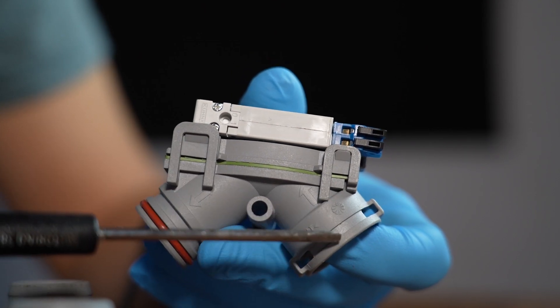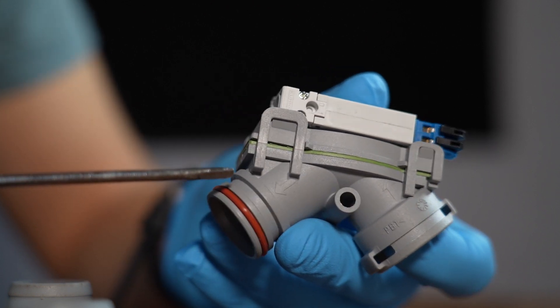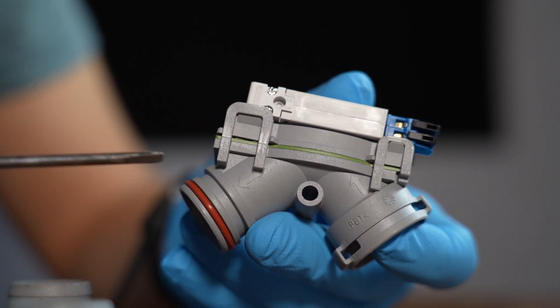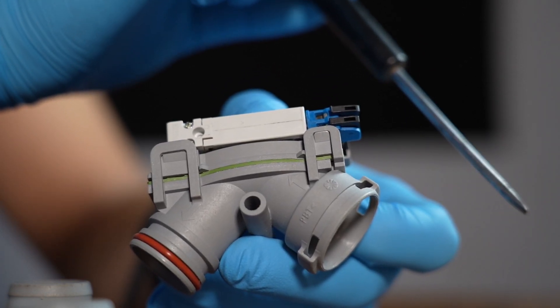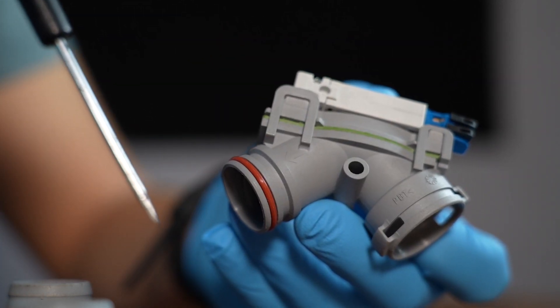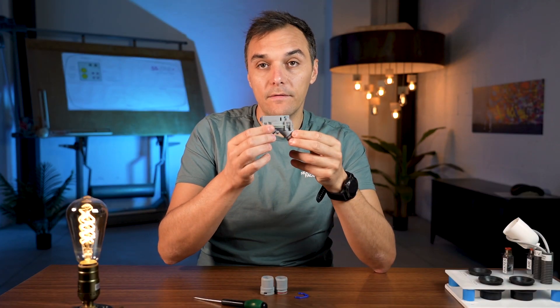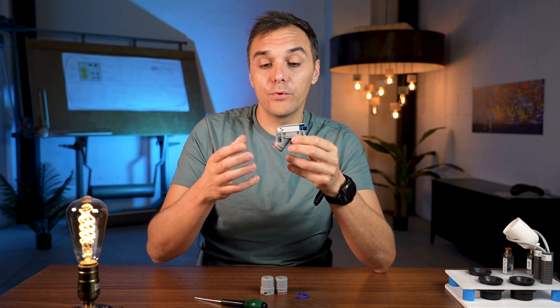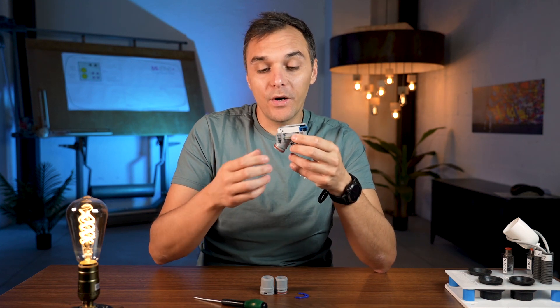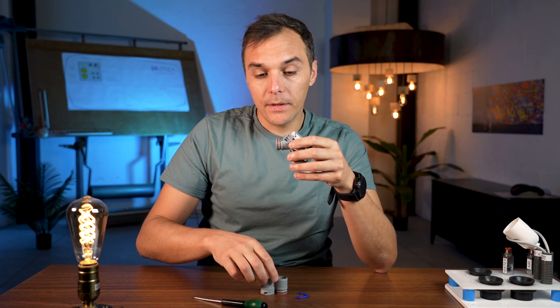We need to take care about the direction of the fluid, because there are arrows on the valve. Considering that you have the dental chair on one side and the suction motor on the other side, we need to follow the direction of the fluid. We cannot put the valve in the opposite position — it needs to be in the proper position, otherwise it won't work.